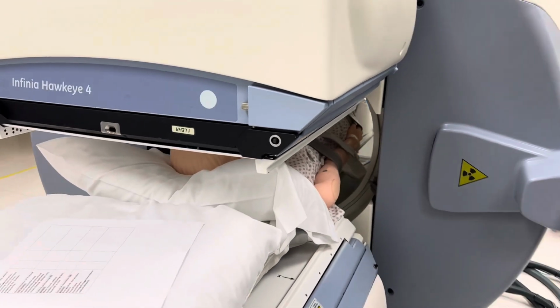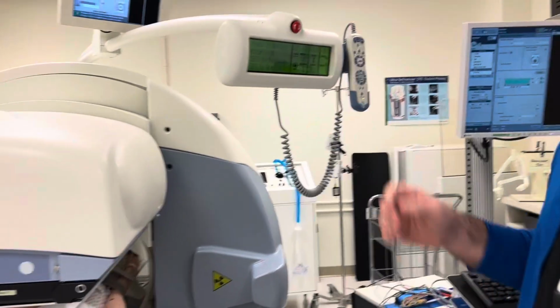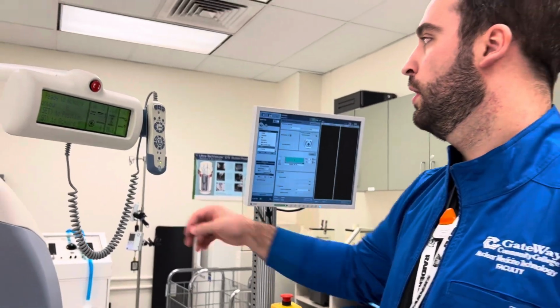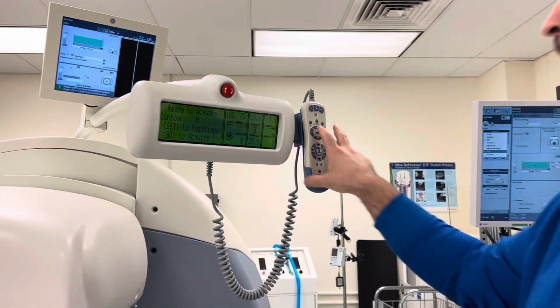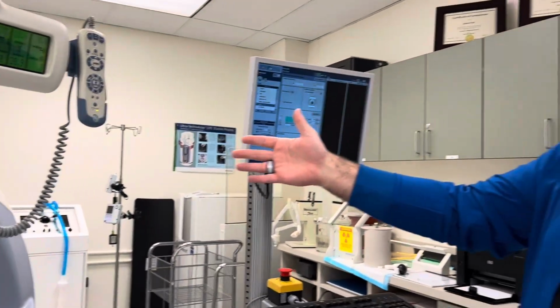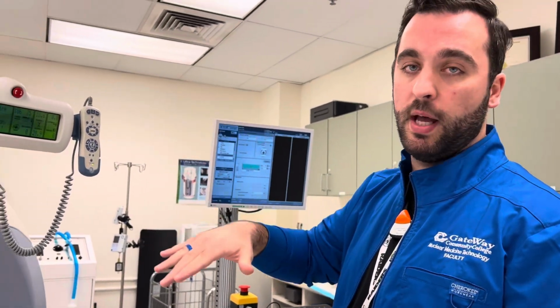Okay, Rosie, we're gonna start now. Just hold nice and still for me, breathe normally. This will take about 22 minutes. Your head will be under the camera for the first 7 or 8 minutes. And then we would hit enable go, and then the pictures would start. And then over 22 minutes, the table will slowly pull the patient out of the detectors as the detector moves in the contour of the body.